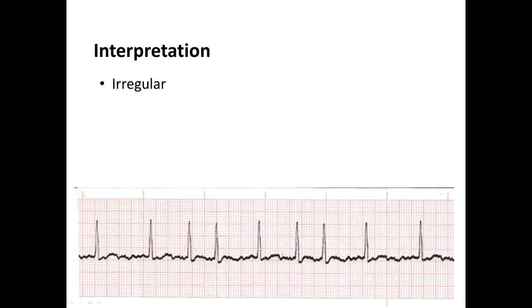Next, I'm going to look at the atrial activity. How many atrial beats do you have? Looking at this rhythm, I can't tell. There's just a big mess in between those QRS complexes, so I don't see any organized atrial activity. So with that, I cannot count atrial beats, I cannot describe the morphology of the P wave, and I cannot measure a PR interval because there's no P wave.